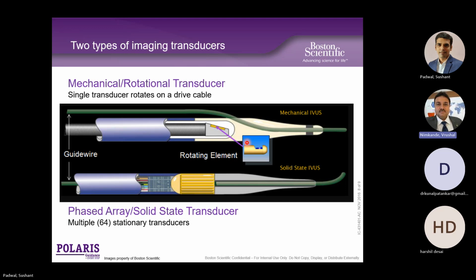That is the only company which has it. That will be very beneficial for a CTO, because without even parking the catheter in the side branch, you can park it on the CTO wire, keep poking the CTO cap, and see the forward-looking image.